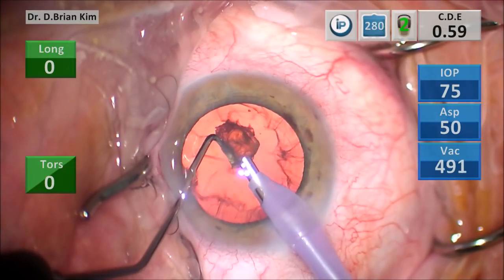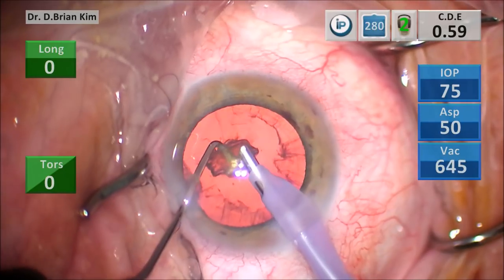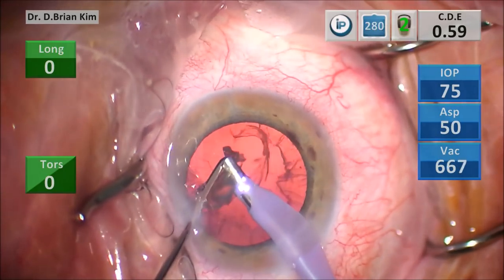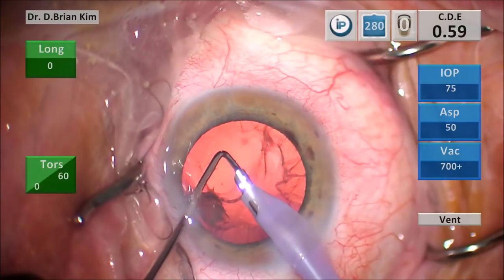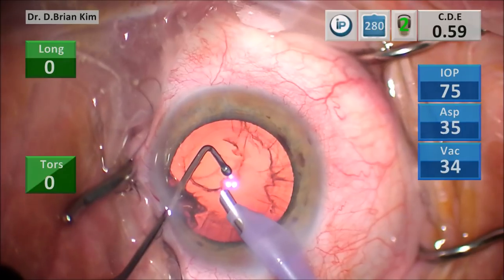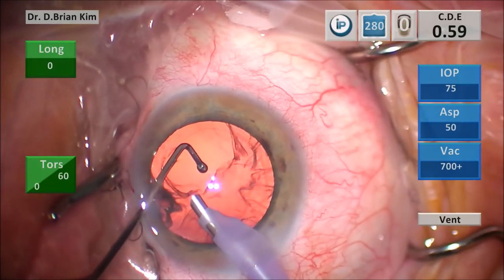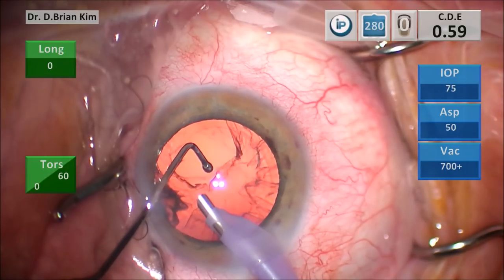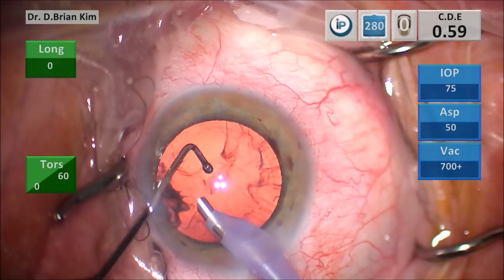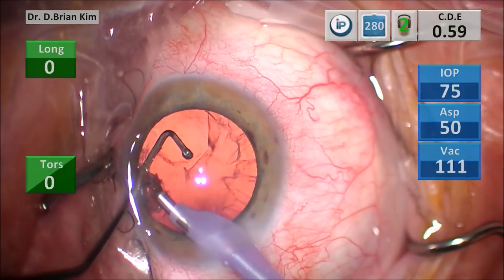My CDE is at 0.59. I'm not using any ultrasound, but you can see the vacuum is very high. And I have the phaco tip fairly low, and as I sandwich that piece, you can see right there at that moment, the posterior capsule breaks. And so my mistake is that I was too close to the posterior capsule with very high vacuum. So obviously this was poor technique, but things happen fairly quickly, especially with my aggressive fluidic settings.